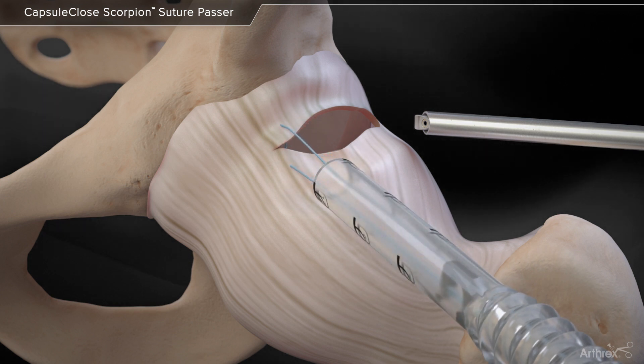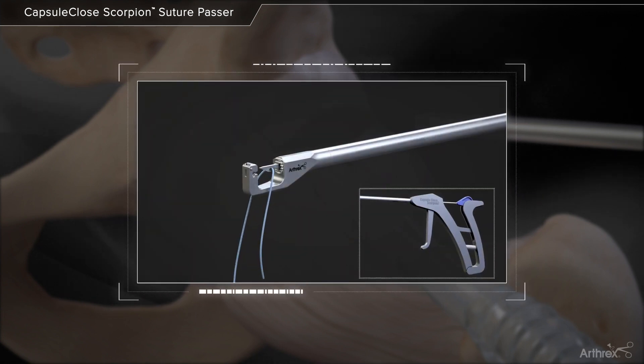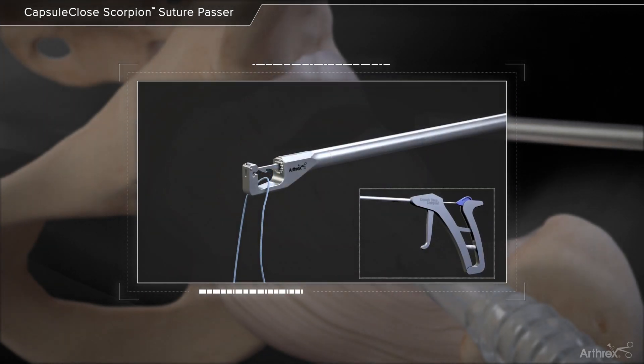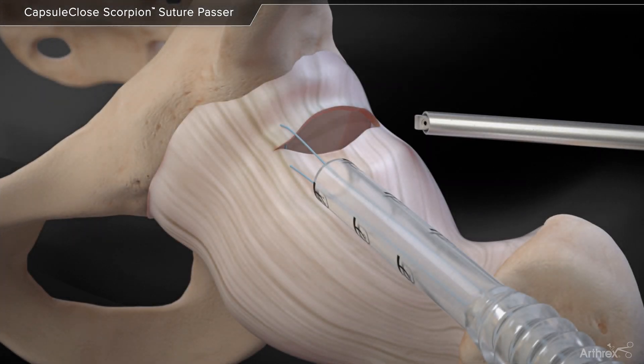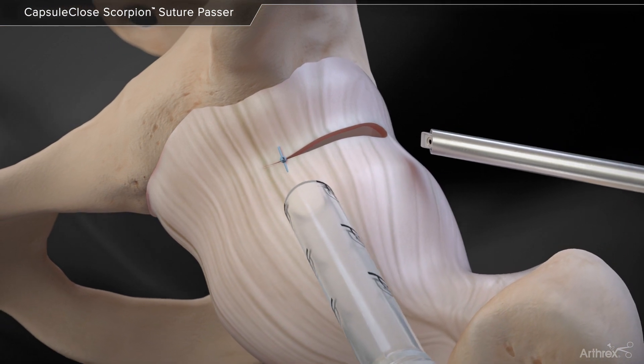Remove the scorpion from the cannula and release the fiber wire suture. Tie a sliding knot of surgeon's choice to close the capsule and continue with additional passes as necessary.